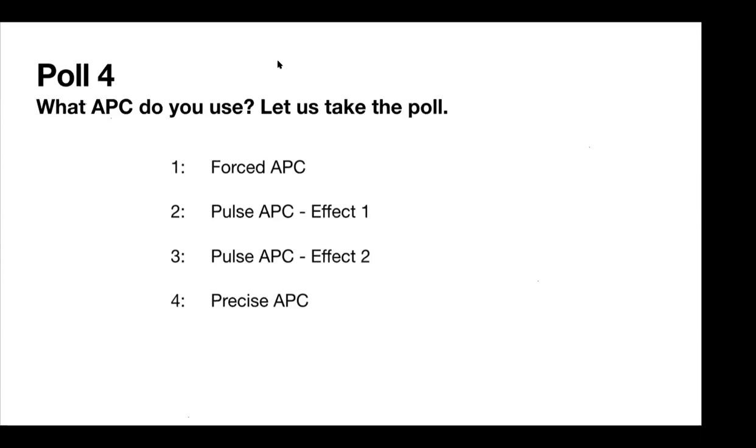Okay. Actually, that's the most important thing. I want the trainees to learn here that the most important thing is you have to figure out and do what is necessary to have the desired whitening of the capillaries or vessels. You don't want to char it brown. Brown means very deep thermal injury. The reason I put it out there is you can actually select any one of those and still get the job done safely.